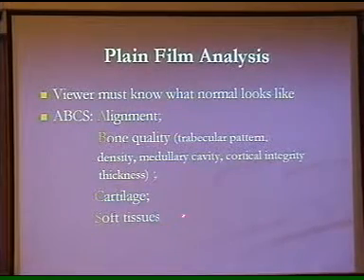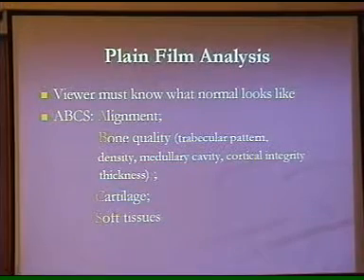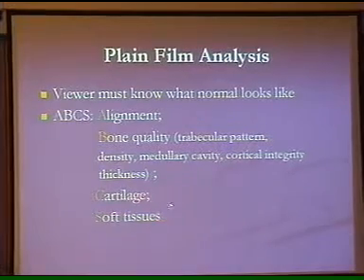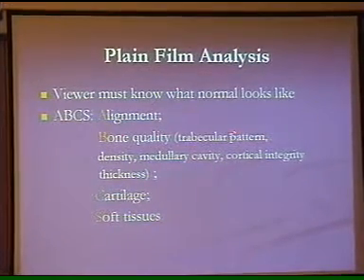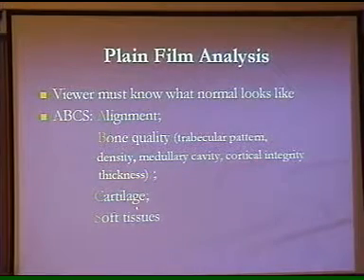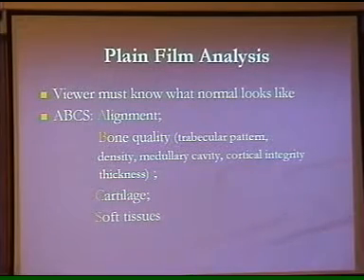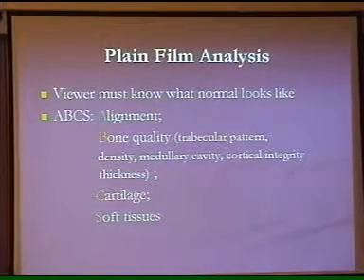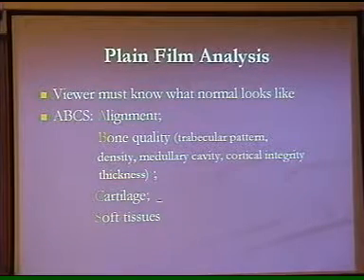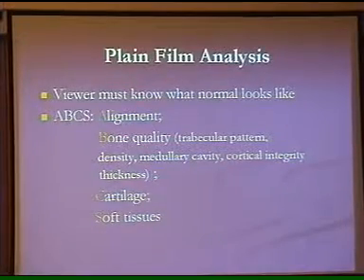And finally, the bone X-ray is not complete until you look at the soft tissues. Soft tissue means the fascial planes, the myofascial planes, in the long bones. The significance of that is, if you find any disease in the bone with irregularity of alignment and the trabecular pattern lost, from the soft tissue you can pick up if it is inflammatory or neoplastic. There are certain entities which are very close to each other, and the soft tissue planes may make the difference between the two. If you find these soft tissue planes well preserved, or just pushed away but still appreciable, then maybe it is a tumor.